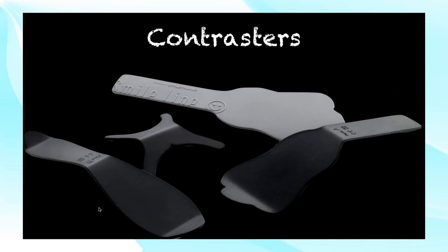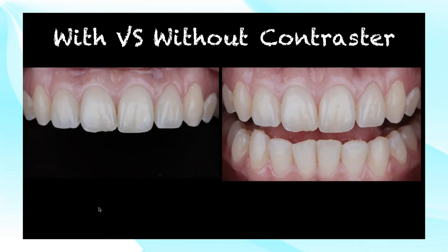The contraster is going to give us that black background behind our teeth. So this is a picture with and without a contraster. This is not Photoshop. Same patient, same day, with a contraster and without the contraster. So if we want to focus on either the top teeth or the bottom teeth, we can take this contraster, put it behind the patient, and take the photograph.